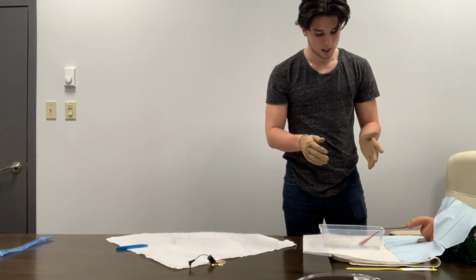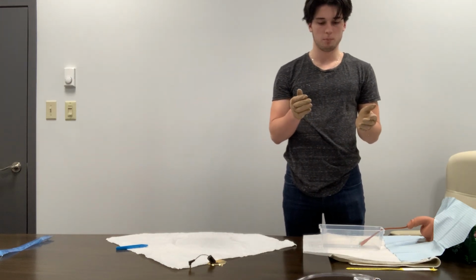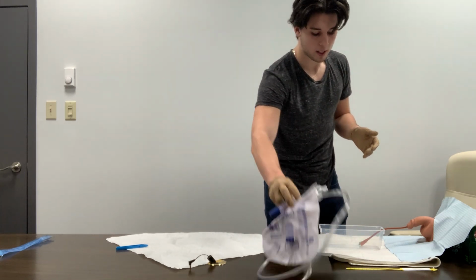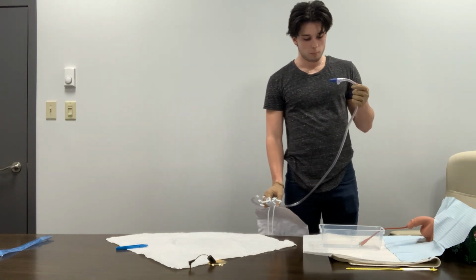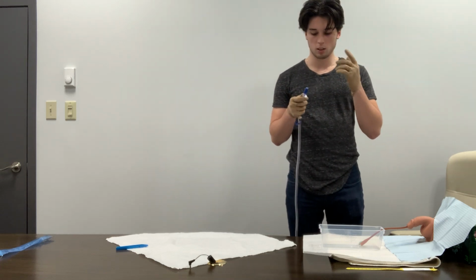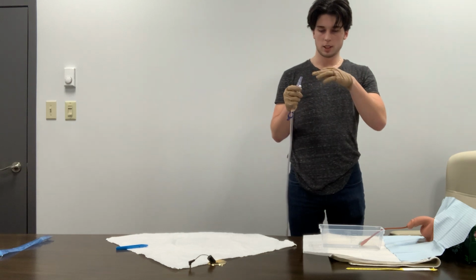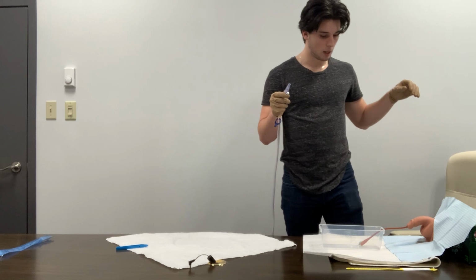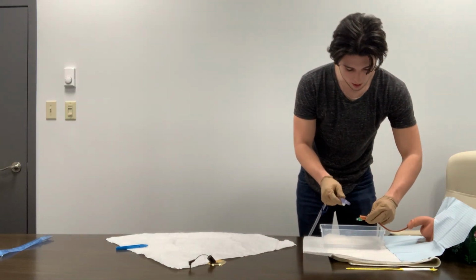And so urine will be flowing out of here, so we're going to keep it in our sterile boat here. And then once that is emptying out, we can go ahead and grab our drainage bag. So we're going to grab this drainage bag here, and we're going to again clip this to a non-movable spot on the bed. And then once that is connected to a non-movable spot, we'll uncap our sterile tip here, maintaining the sterility under the cap. So this is considered sterile.